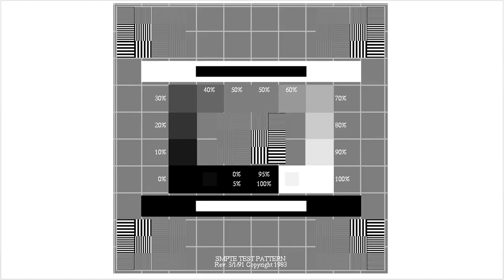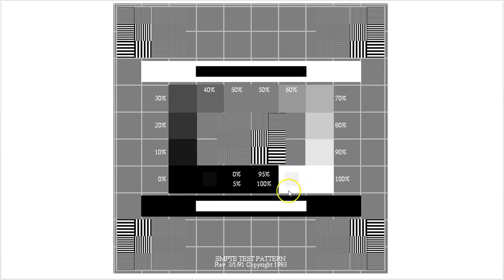The SMPTE pattern looks like this. What you want to see is the gray box inside the black square — that's the 5% box — and the gray box inside the white square — that's the 95% box. If you can see both of those boxes, the monitor passes the test.